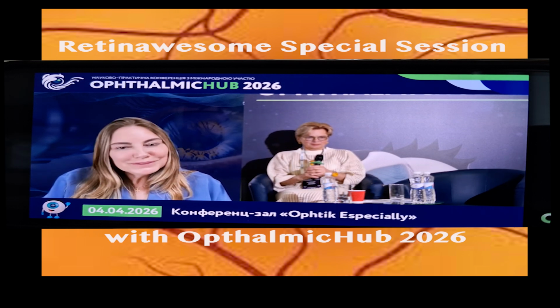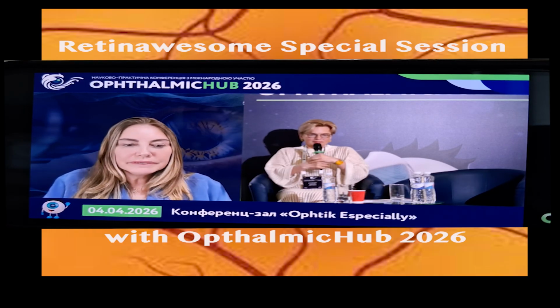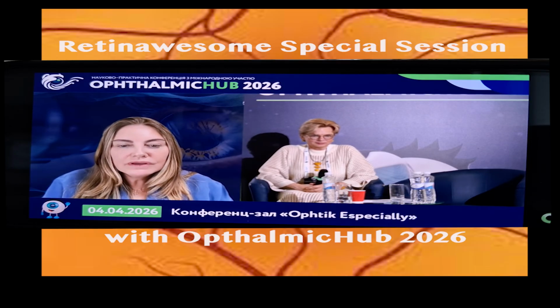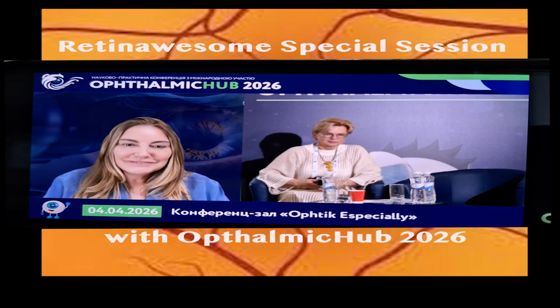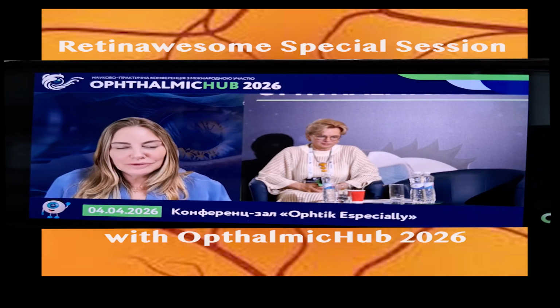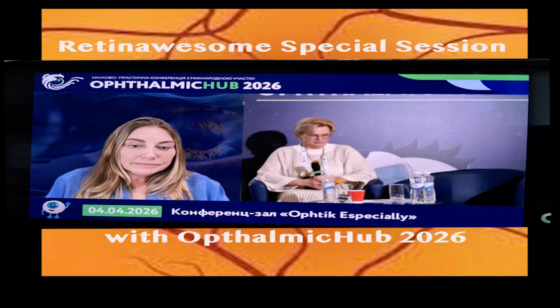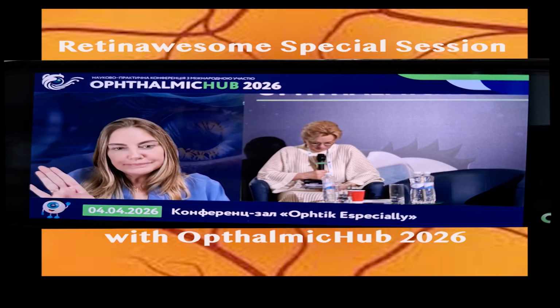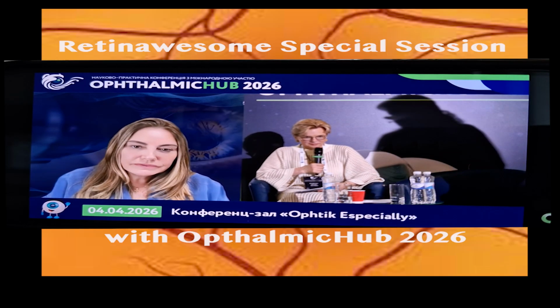Well, not in my cases, I don't have a very long history of macular buckling. I started doing it 3 years ago, and I have more or less 10 cases, and thank God I haven't had any kind of complication. Yes, we can have, for instance, diplopia. We can have strabismus, a small amount of strabismus.